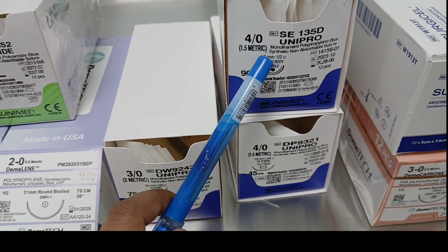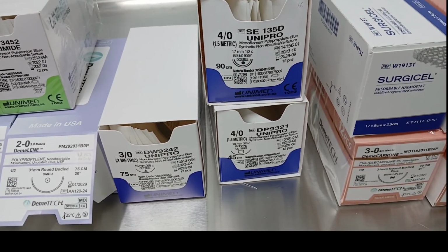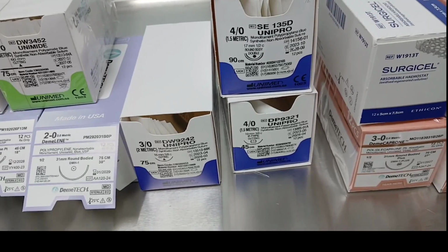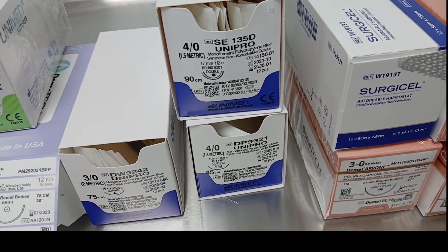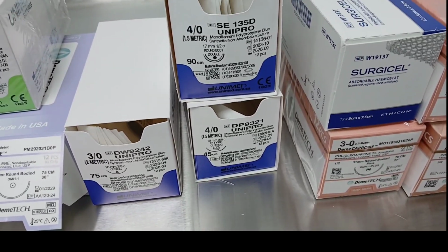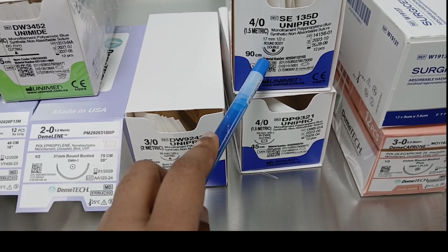Then what we have to see is what kind of suture is being used. According to the surgery, according to the patient condition, the doctor will ask for the suture. So we have to know about the suture material, what different types of sutures we have. And we have to see single needle or double needle. You can see this is the single needle, this is the double needle.